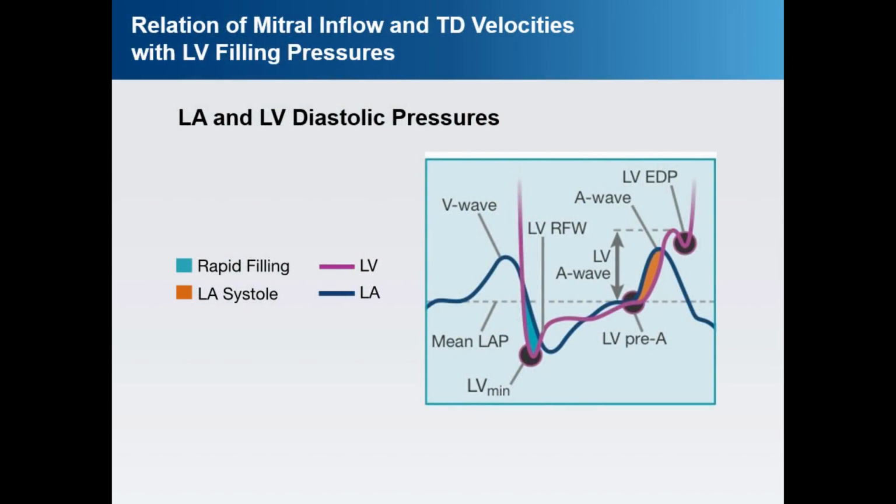So many of you are familiar with the topic of diastolic function. Diastolic function, strictly speaking, is a lot of things that can be assessed. It was described first invasively, looking at the rate of LV pressure decline during the isovolumic relaxation period. It's also looked at as the rate of rise of LV pressure with respect to filling, how fast the pressure rises as filling of the ventricle takes place during diastole. And it is possible to derive variables, but you need high fidelity pressure catheters to do that.